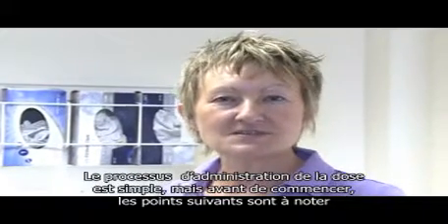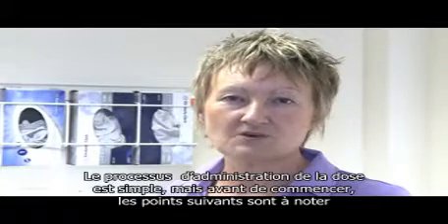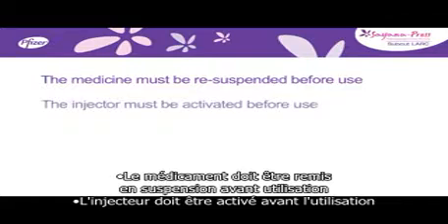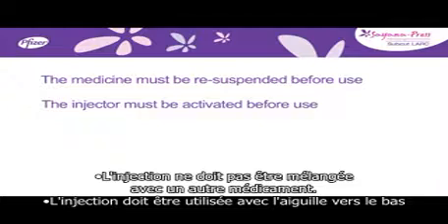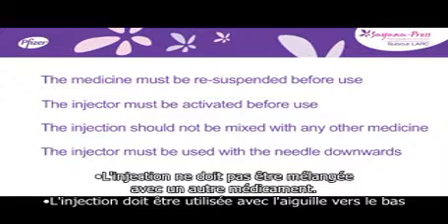The process of delivering the dose is a simple one but before we start the following points are important to note. The medicine is a suspension that settles during storage and must be re-suspended before use. The injector must be activated before use. The activation process pierces an internal seal so that the medicine can come out through the needle when the reservoir is squeezed. The injection should not be mixed with any other medicine and the injector must be used with the needle downwards.